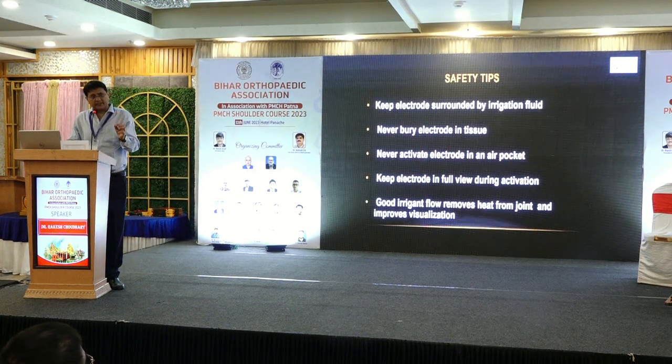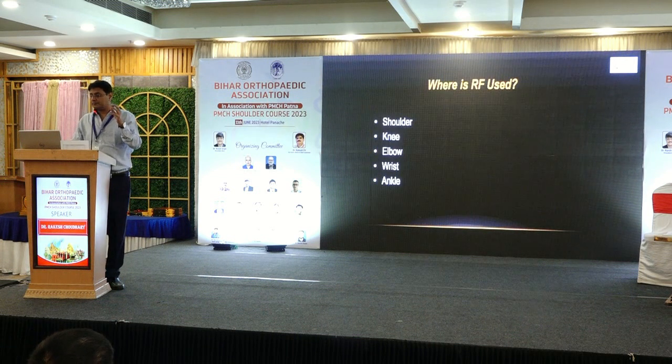There are a few safety tips. Keep the electrode surrounded by irrigation fluid. Never bury the electrode into the tissue. Never activate the electrode in an air pocket. Keep the electrode in full view. And good irrigant fluid removes heat from the tissue.